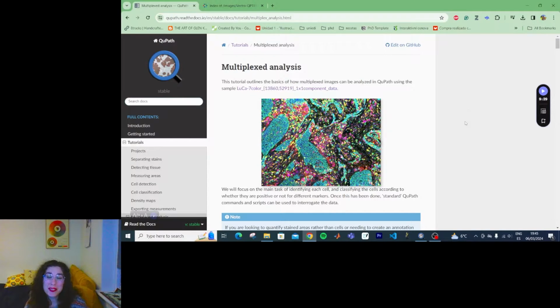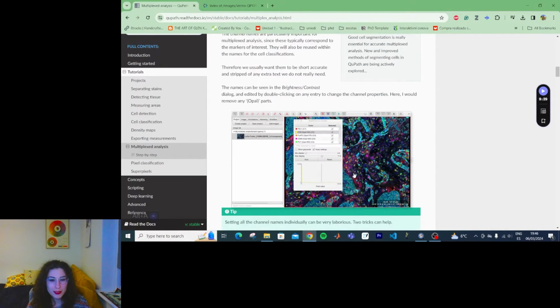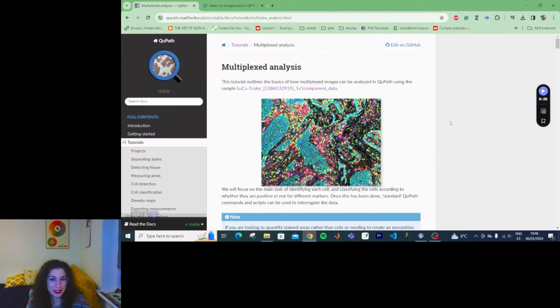Hi! Today we're going to be following this tutorial on multiplexed analysis. Truth be told, I'm not used to working with multiplex images. I'm not even sure I understand them, so a little bit scared about what's going to happen today. But the good thing is, most of the things we've already been through, so it's all about classification and cell detection. Hopefully it will be fine.